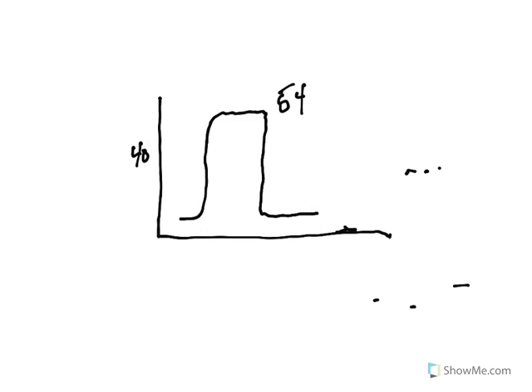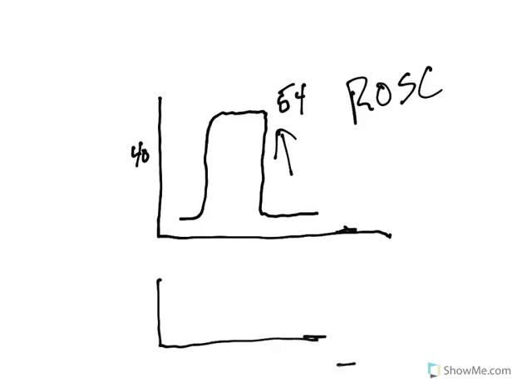This could be a patient who you just got ROSC on. If you see this with ROSC, you should expect that your patient is probably going to do okay. So keep up what you're doing and take care of that patient and make sure that they do okay.